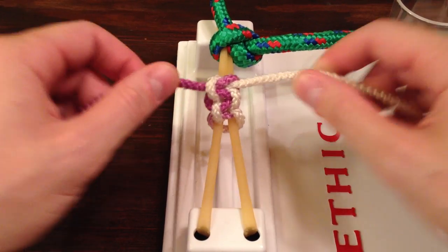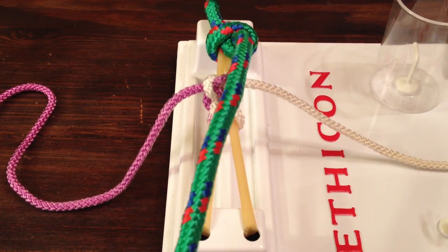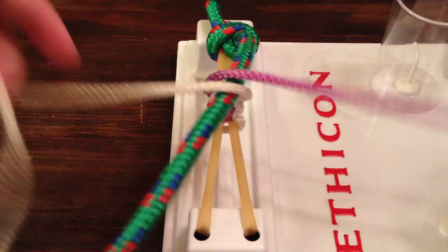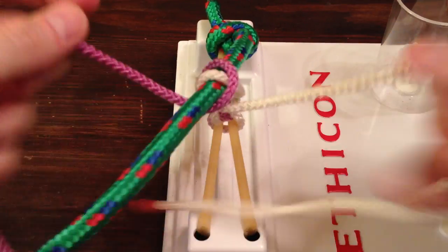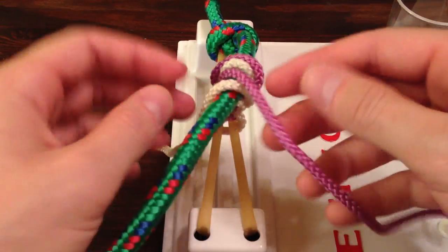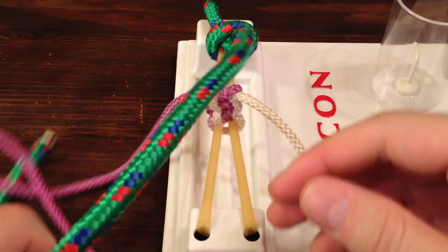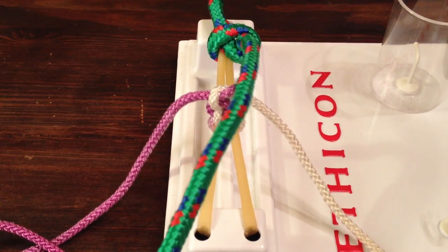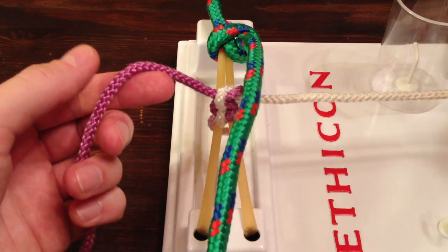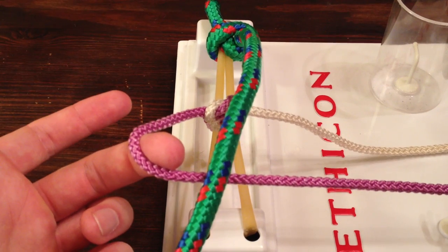So we've tied our string to the skin. Next, you're going to take your drain and drape it over the top. Now the old drain stitch I knew involved taking these strings and wrapping them around several times, trying to keep it tight, trying to make it look real nice, and tying overhand knots here and there — it just got really confusing and hard to keep straight. The stitch I'm about to show you is a lot easier and it involves just one side at a time. So we're going to start with the left side, and we're going to form an L — an L underneath the drain.